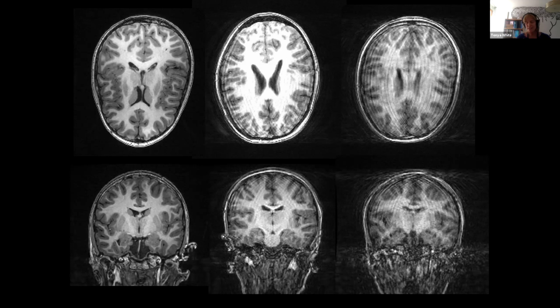So there is evidence that quality of structural images, and I'll actually show you this in this algorithm, but going back to, for example, Jay Giedd and the NIH sample and other groups, have shown that the quality rating does affect different measures such as cortical thickness and volumetrics that you're doing. And so it's to as much as possible remove bias associated with movement. And then you want the highest resolution instrument. You want an instrument that is more continuous than just yes, no. Because then you can actually also add it as a potential covariate in your analyses.